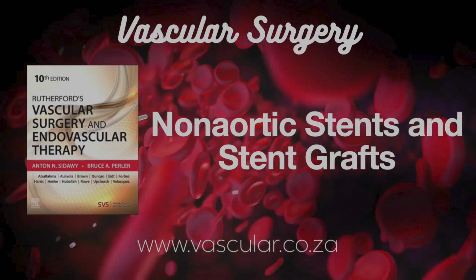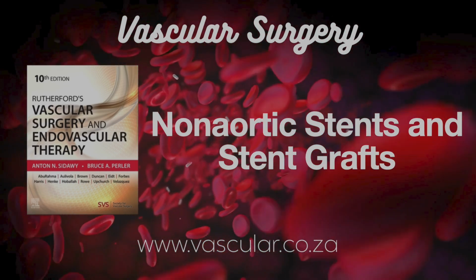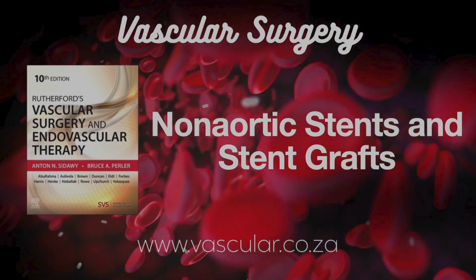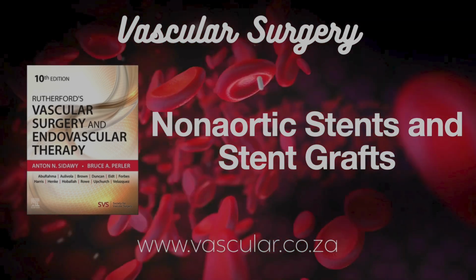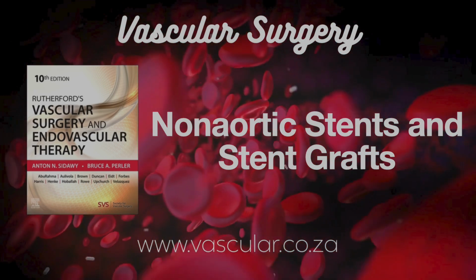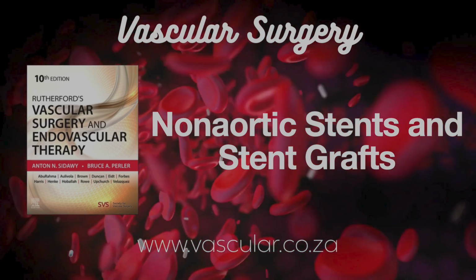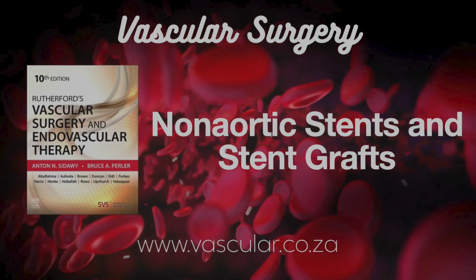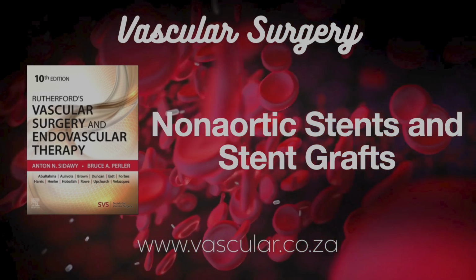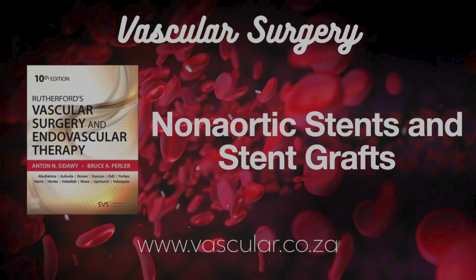Now, what about the blood flow itself? How does this stent change things there? That's the other side of the coin, fluid dynamics. Stents change the flow patterns. A big factor is creating areas of low wall shear stress, or WSS. WSS, wall shear stress. Yeah. That's like the friction of the blood against the wall. Exactly. And too little friction, low WSS, seems to be a bad thing. It actually encourages that tissue overgrowth and re-narrowing. So how does the stent create low shear stress?